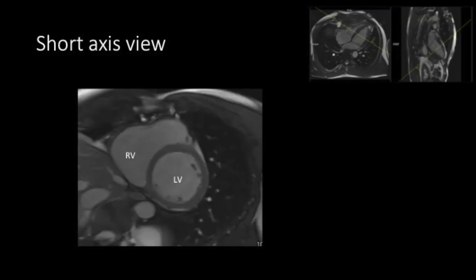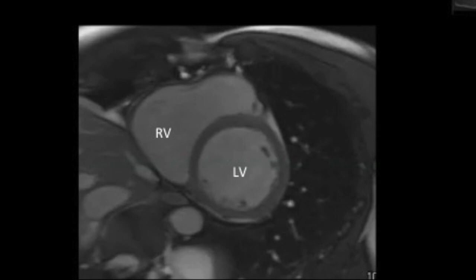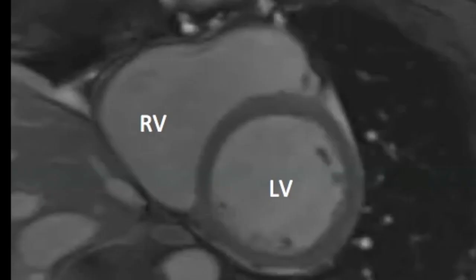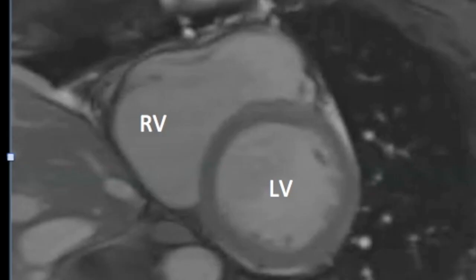Now the most important view is the short axis view which we obtain as a stack from base to apex to look at the LV wall thickness and the wall motion. The left ventricle again is seen as a complete circle with the myocardial lining which is thicker as compared to the right ventricle which is seen as half a circle. This is the short axis view.